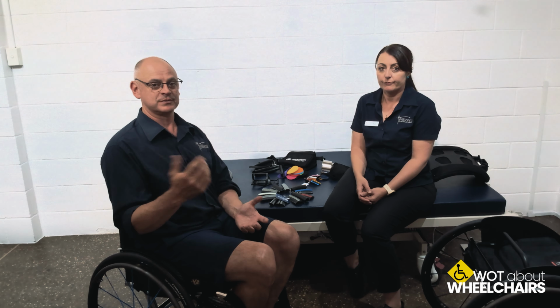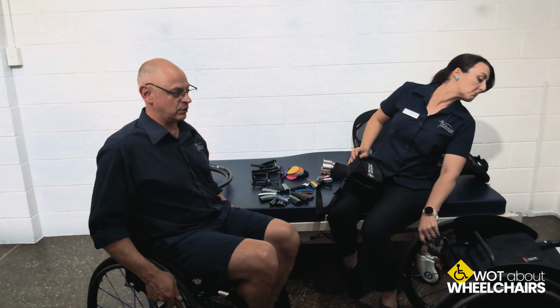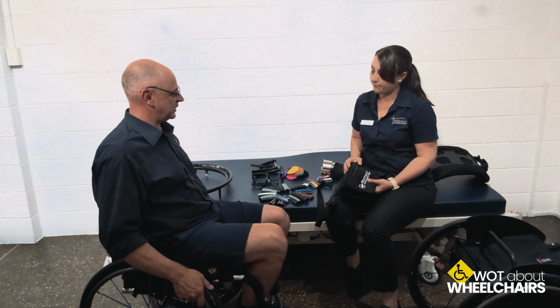It's like me, who's able-bodied. I have different sets of shoes for different purposes. I've got running shoes, hiking shoes, and then I've got office shoes. You might have different wheel setups depending on your surface and what you're actually using it for.